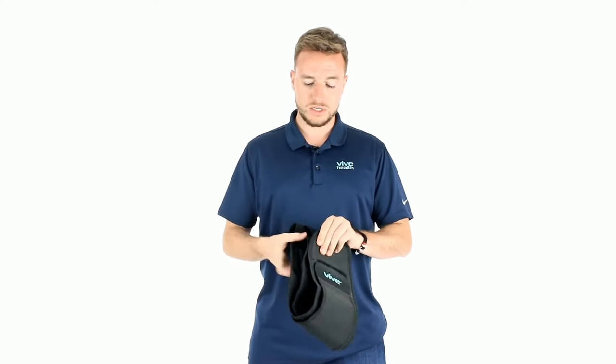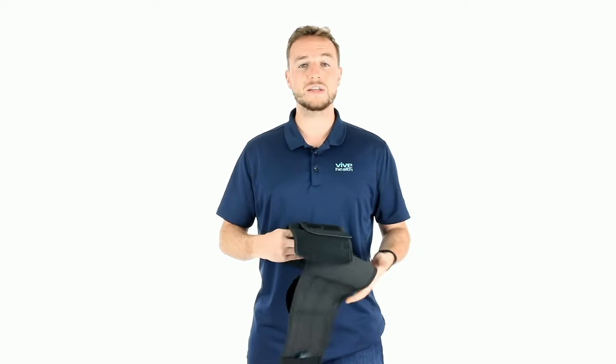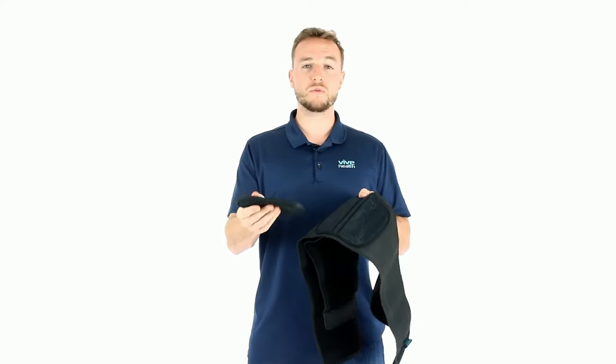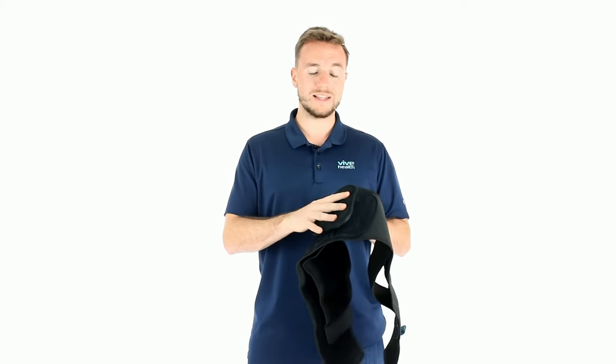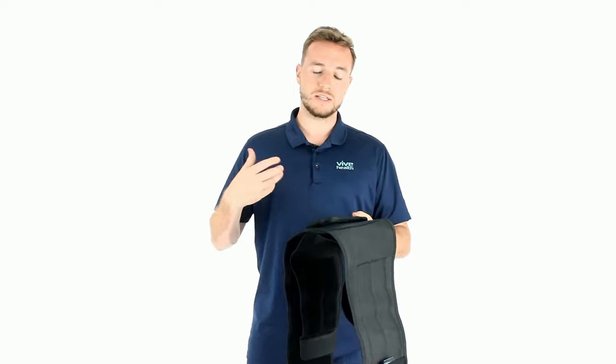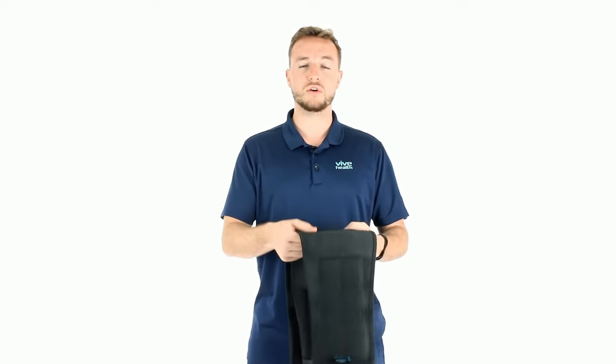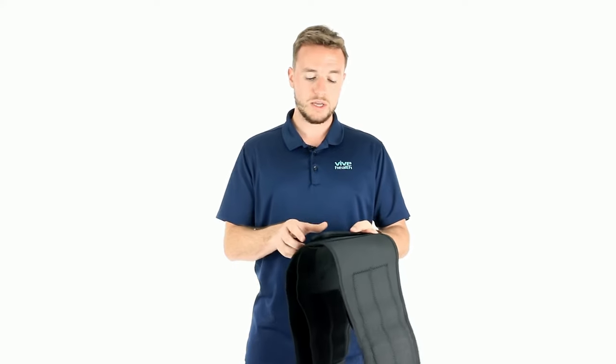It's a two-pull back brace with a removable panel and plastic stays. This panel is removable, so as you get less and less acute pain, you can take this off or you can leave it on. It also has plastic stays as well.